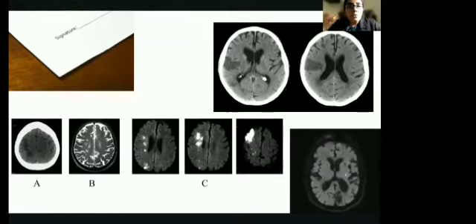So this is a hemodynamic kind of infarct, where you can have a shower as well as flow which is restricted, which is the reason why you get both an embolic infarct, which you are seeing here, as well as a chain or pearl sort of signature infarct in people with carotid blocks.